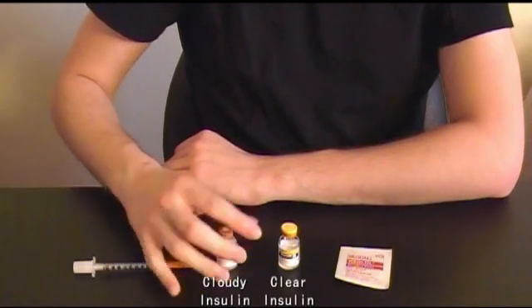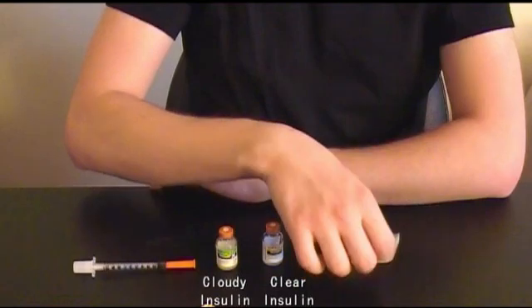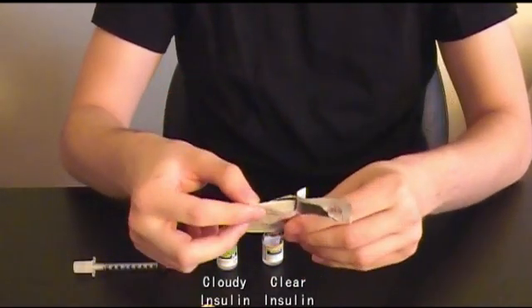Remove the caps off both of your insulin vials. Then wipe both of the rubber stoppers with an alcohol pad.